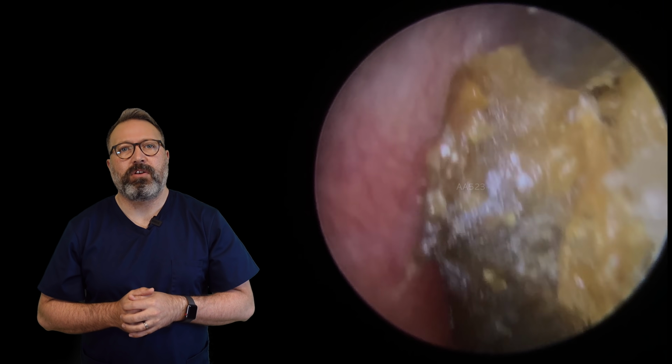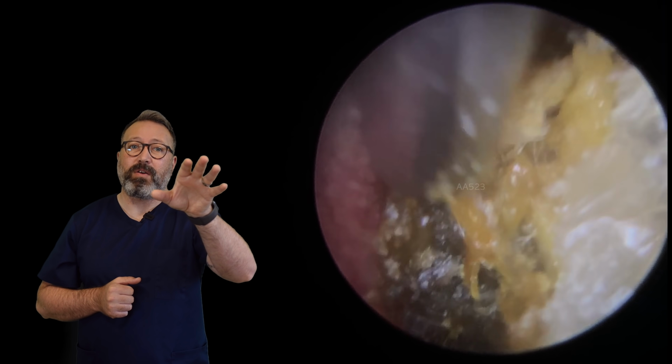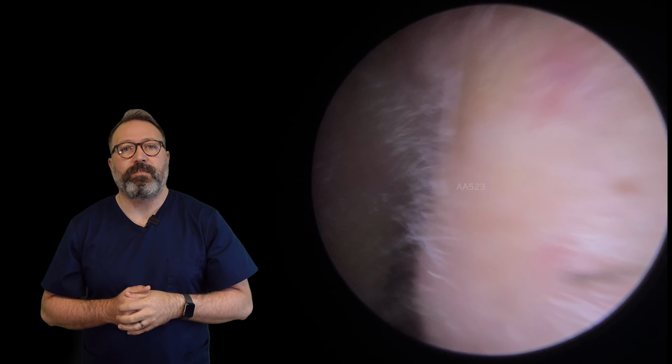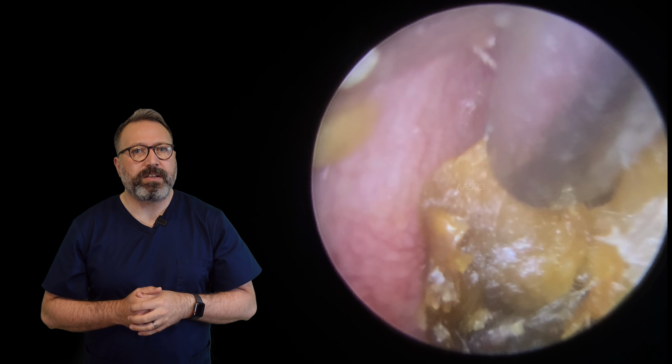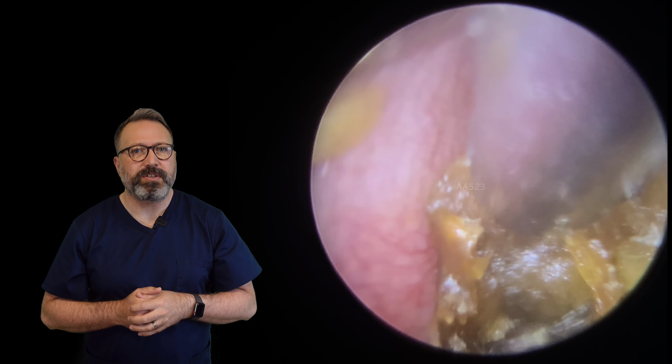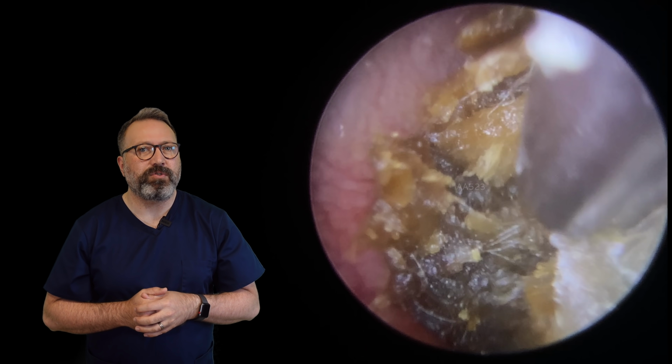This patient is having lots and lots of hearing issues, and understandably so. When you see the size of this plug, and that's without what we've already taken away, it formed a really good blockage in here. Let's see if we can get this top section of wax moving. That did have a little bit of movement to it just a second ago, so let's see if we can exploit that a little bit. It just broke away, unfortunately.